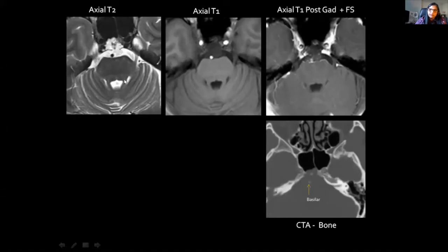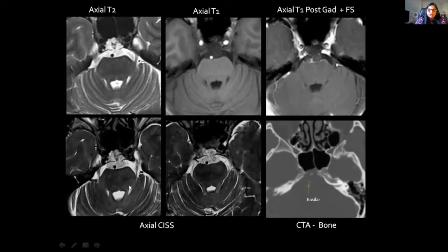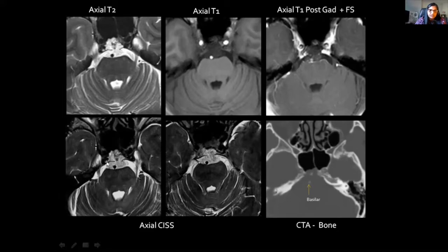Another example — this time a midline tumour, again quite high signal intensity on T2 compared to brain stem. On T1 it is lower in signal. Post-contrast, there is relatively very little enhancement. CT shows a lytic process involving the clivus with a small area of splayed bone. The CISS sequence beautifully demonstrates the dural breach, the intradural tumour component, and — since this is a non-enhancing tumour — the tumour margins with respect to CSF and its relationship to the basilar artery. This is a chordoma.